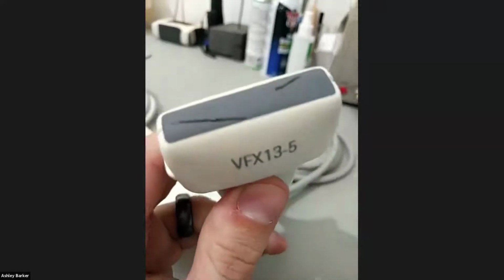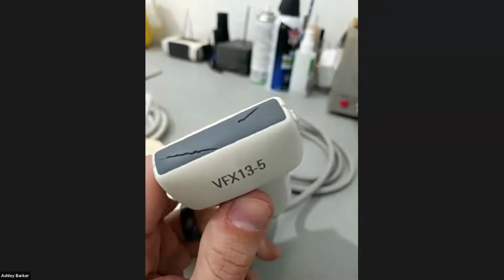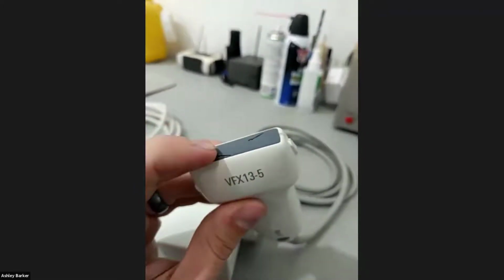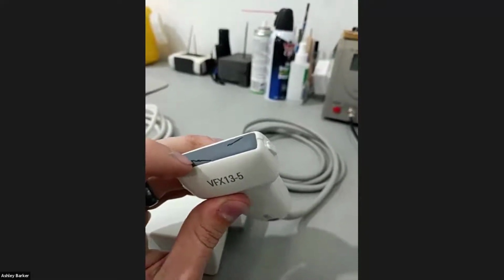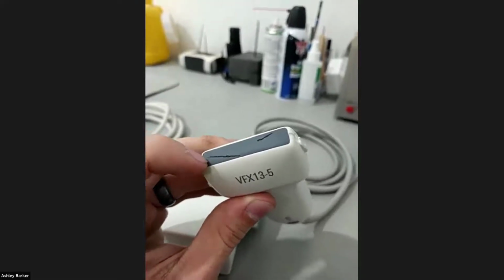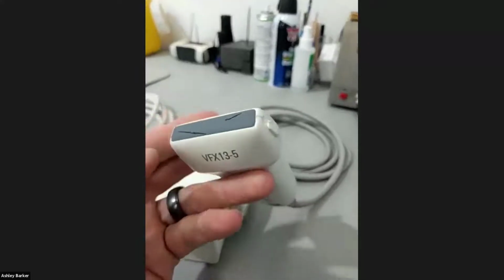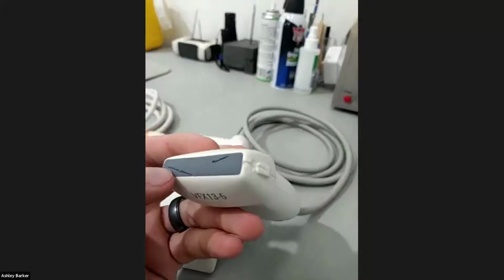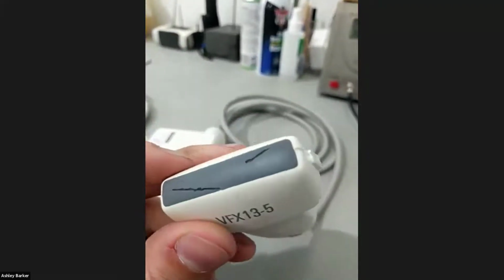So basically someone hasn't been careful when doing injections and they've stabbed the needle straight into the end of the probe. And that's okay if it just takes out the actual lens material, but if it were to do that, you want to get it dealt with quickly, because if water gets into your array, it'll corrode the array. And so it's important to get it dealt with quickly, and you start getting lots of horribleness, and it's an infection control problem and all these sorts of things. But yeah, basically that's not what you want to do with needles.